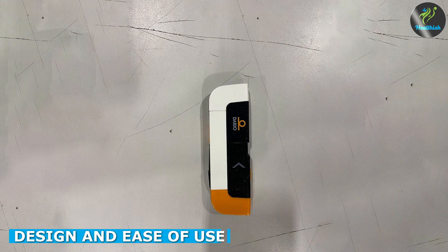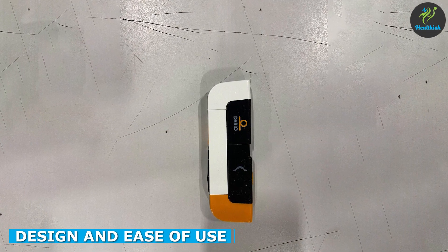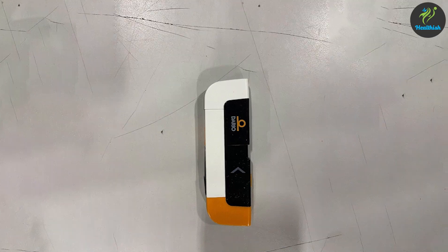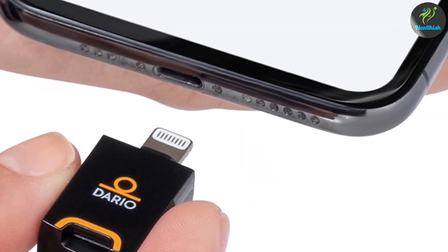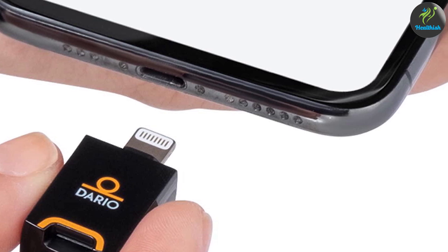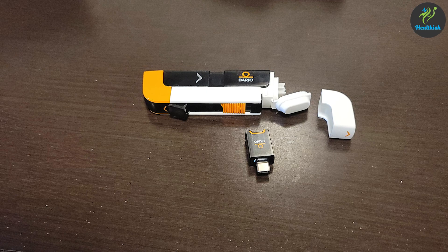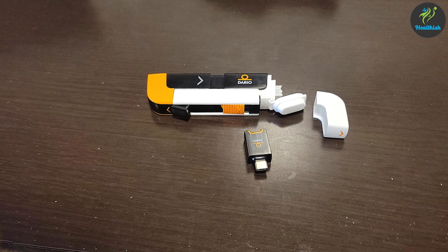First impressions matter, and the Dario Blood Glucose Monitor Kit certainly delivers in terms of design. It's a compact device that conveniently plugs into the lightning port of your iPhone. The sleek and minimalistic design adds a touch of elegance. The device is lightweight and pocket-friendly, making it easy to carry around wherever you go.